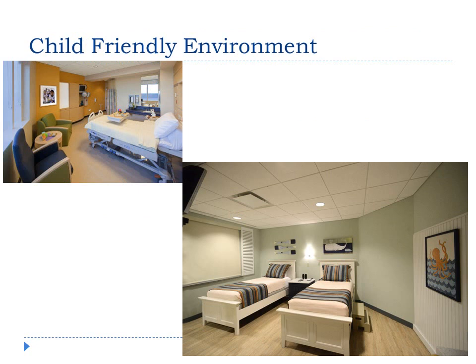Let's take a look at the environment for the pediatric polysomnogram. We really don't want to bring a child into an adult environment and expect them to feel comfortable and be able to have a good night's sleep. So we want to bring them into an environment that is built for them.